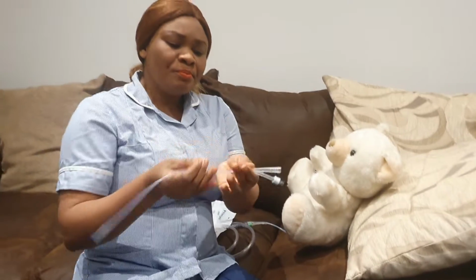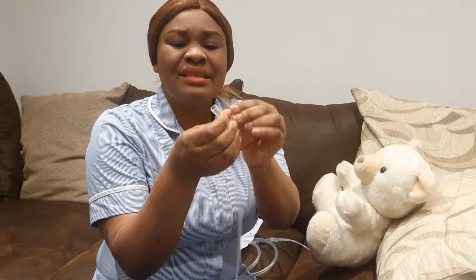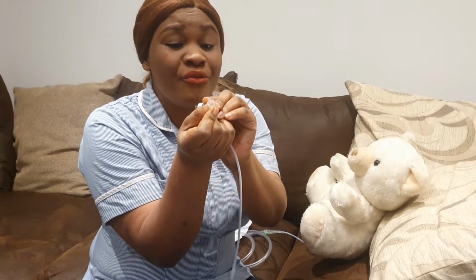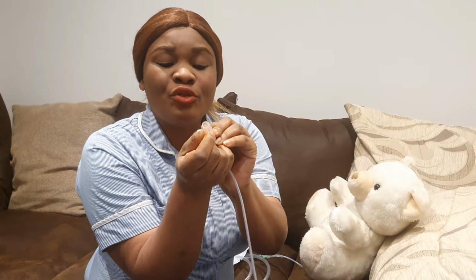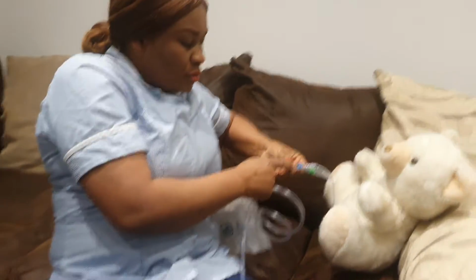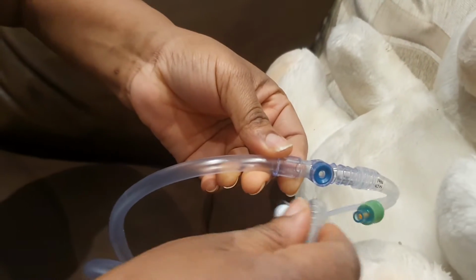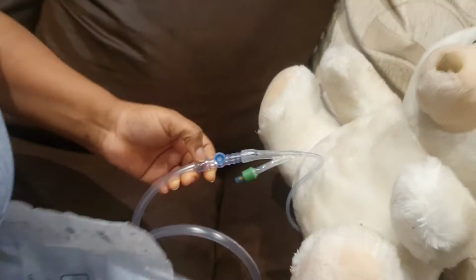Now, this is a catheter, and this is where you are expected to collect your sample from, because if you go collecting your sample from this place, it means you're removing the catheter. So this is not a site for you to collect sample from. Where you need to collect the sample is from the sampling pod, and this is the sampling pod. We've seen cases where you tell people take sample from your catheter and you see them removing the catheter because they go and collect the sample from this place. So guys, that's number one.